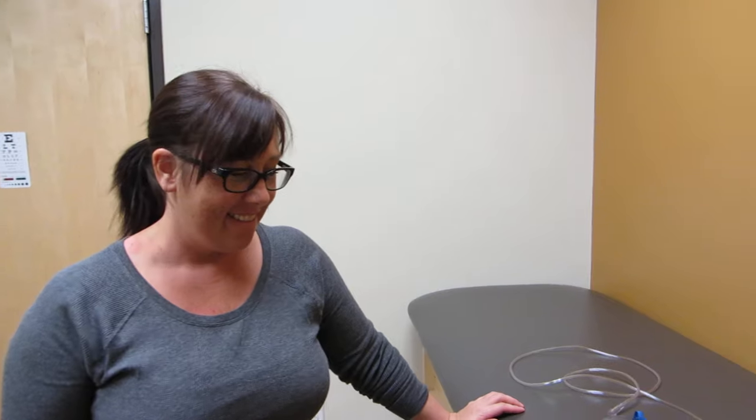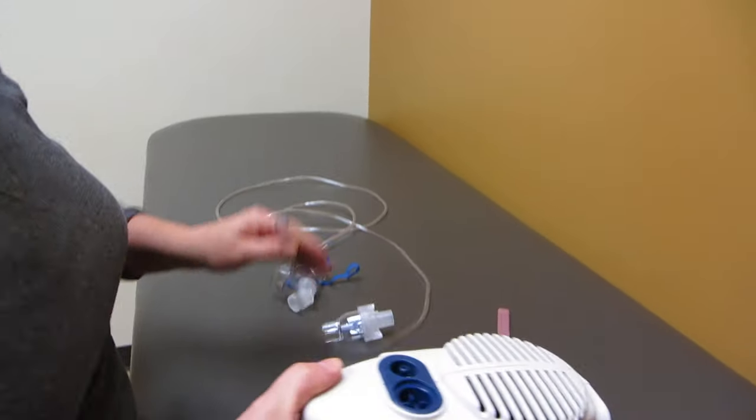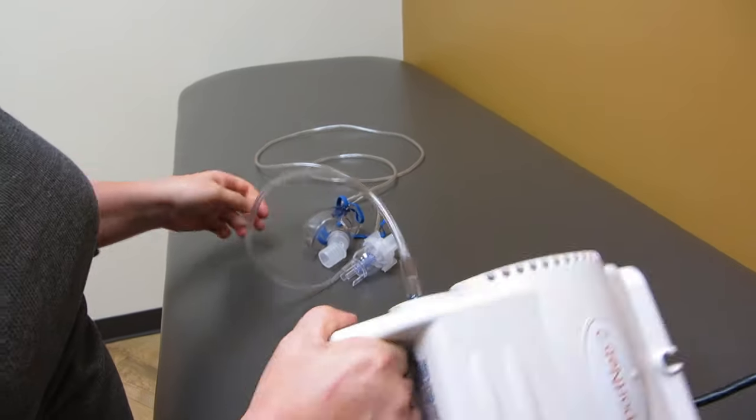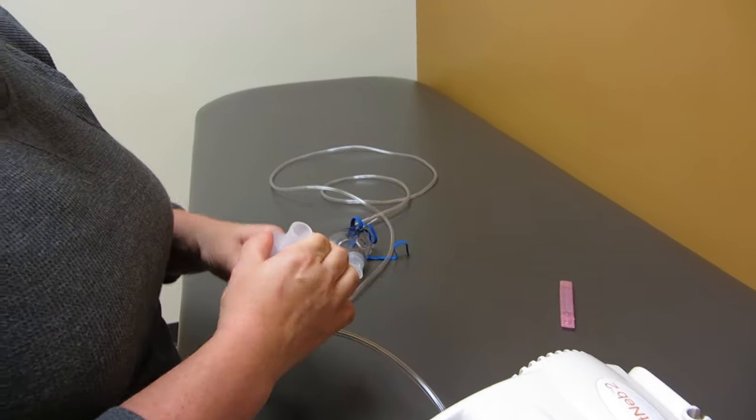We're here today at Pediatric Associates with Lynn, who's going to show us how to use a nebulizer to set it up for home use. All right, take it away. All right, so we have our nebulizer, and you can see she is hooking up to the output the tubing.